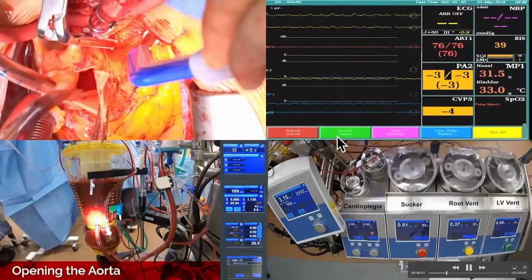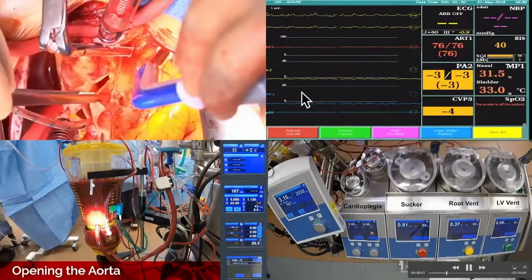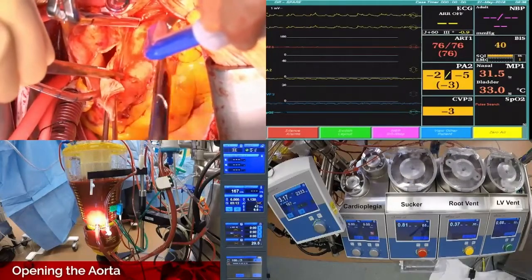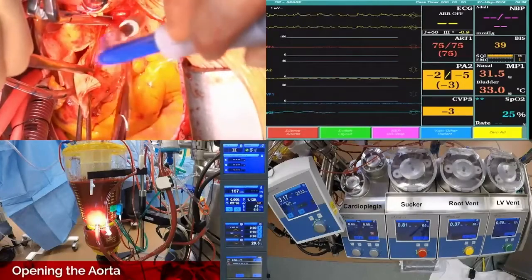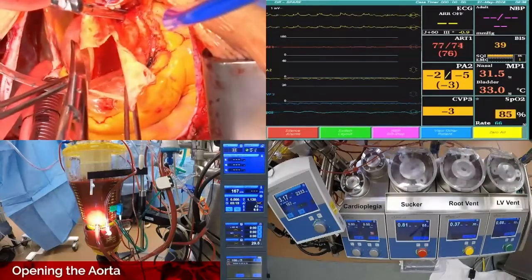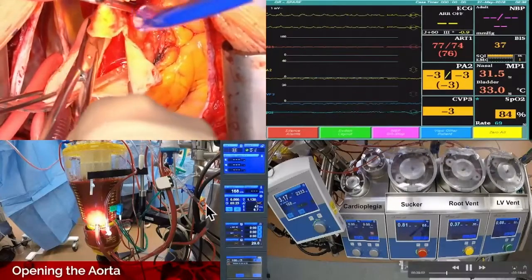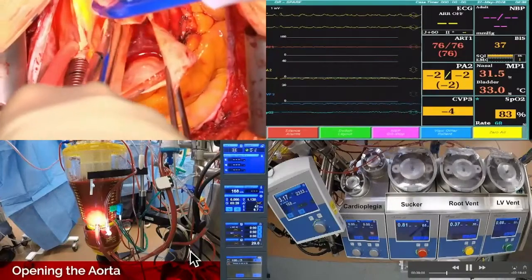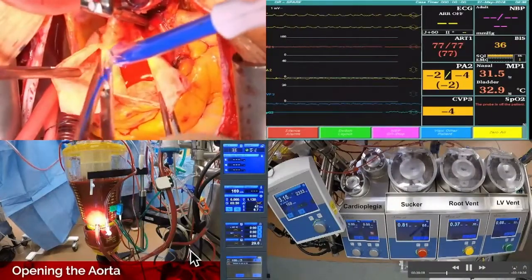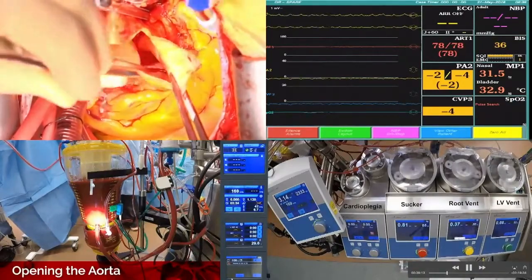Right. So basically, I'm going to make a longitudinal aortotomy, and then I'm going to make some cuffs right here, approximately distally. I'm digging down toward the left main right here to make sure we don't get too close to the left main because I want to make a nice sinotubular junction. Now I'm going more toward the head and toward the aortic cannula. I get pretty close to the aortic cannula. There's usually, if it's a normal aorta, right before the arch, a nice cuff inside there, a transition zone. And on this one, it's pretty straightforward that it was there.